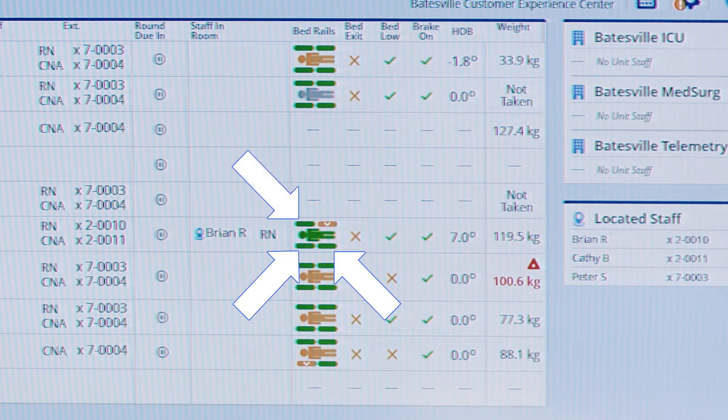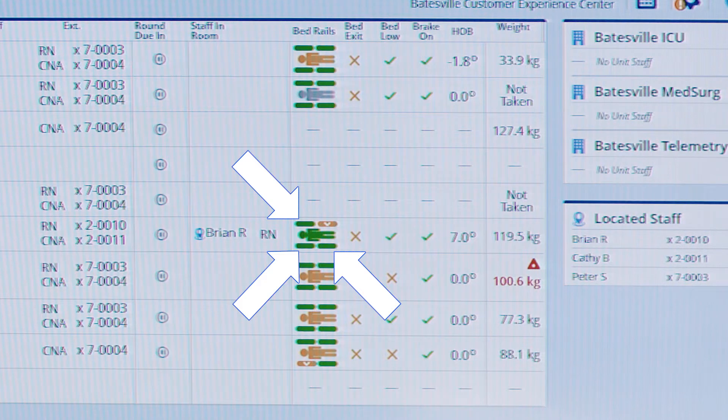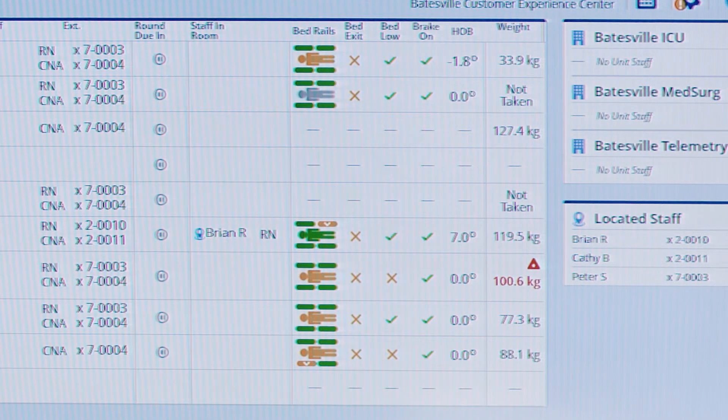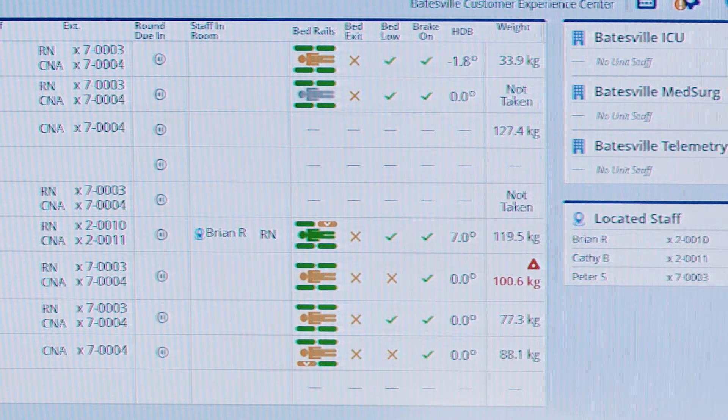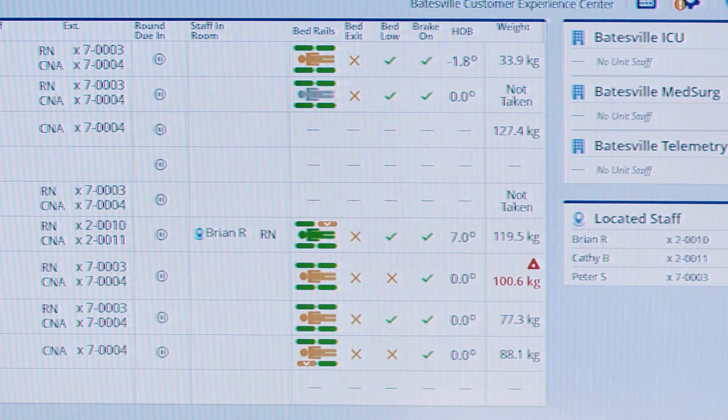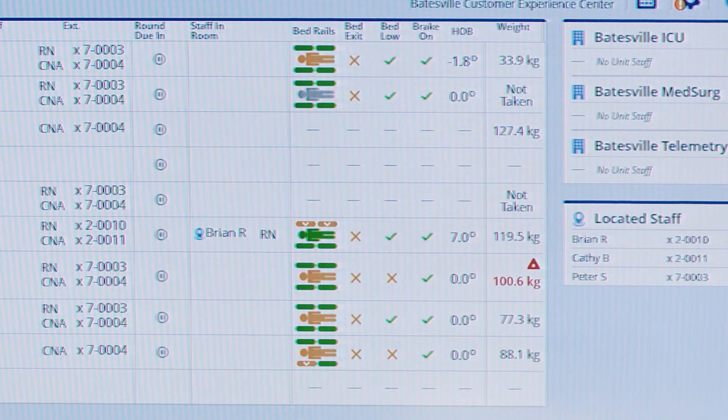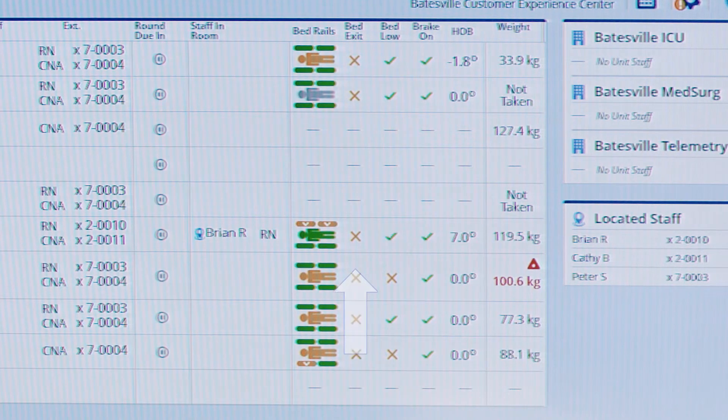Currently we have a bed that's located in room 200 with three side rails up, one side rail down. At any time the patient lowers a side rail, we receive an immediate response that there's been a change in the patient's safety environment.